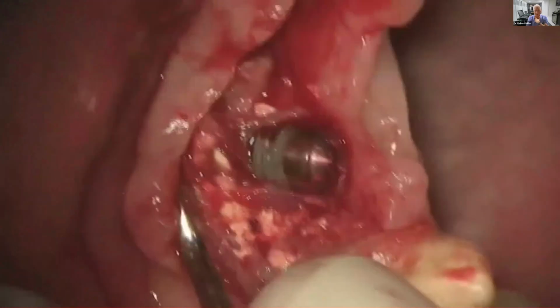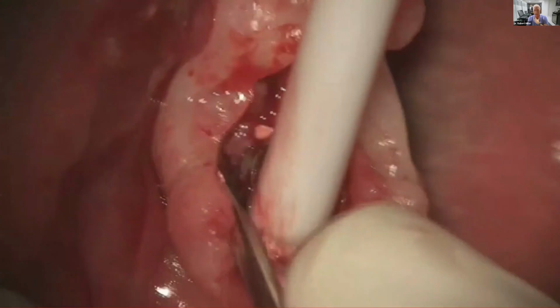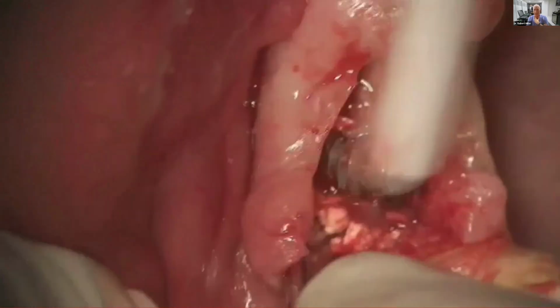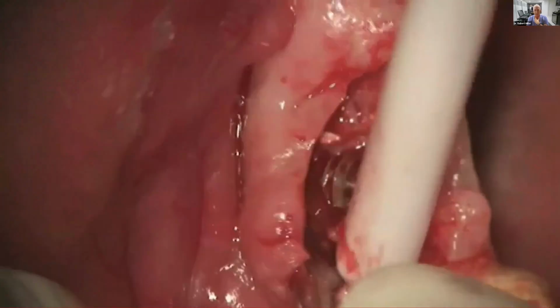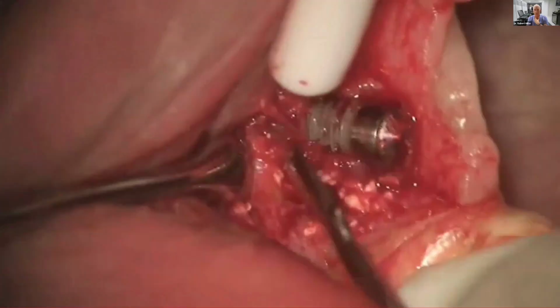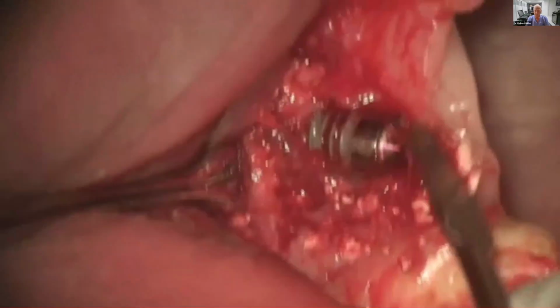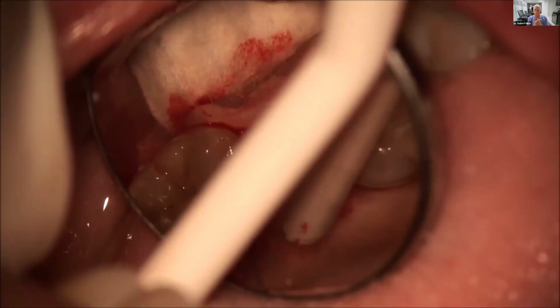And there, Carl Misch, the late great Carl Misch, had an affectionate name for this. He used to call this hydroxycrapatite, because that's exactly what it is. It doesn't function to grow bone around this implant, and therefore this is a failure. In fact, it failed so badly that it caused the bone to be lost, and then the entire implant had to come out.